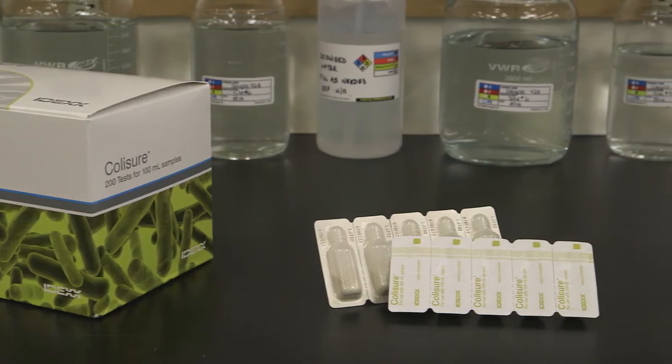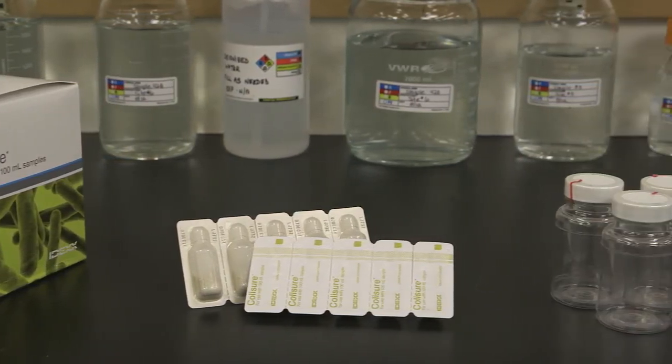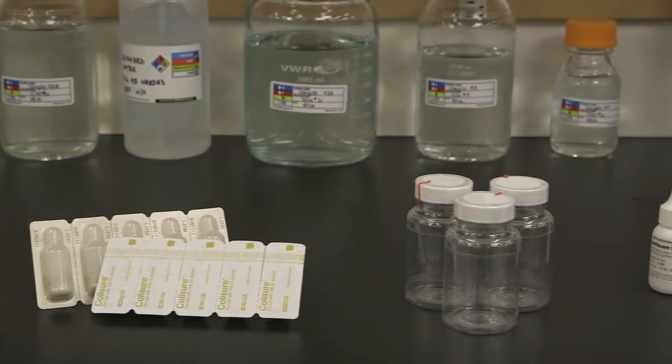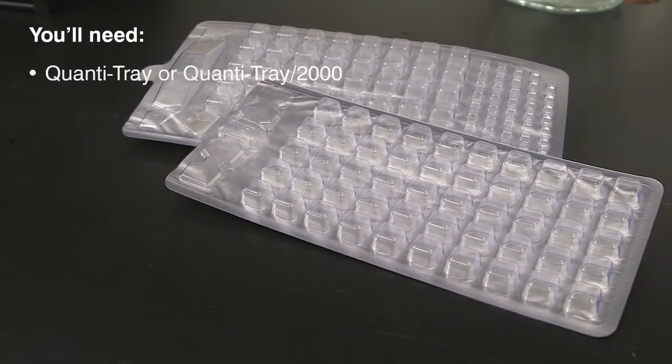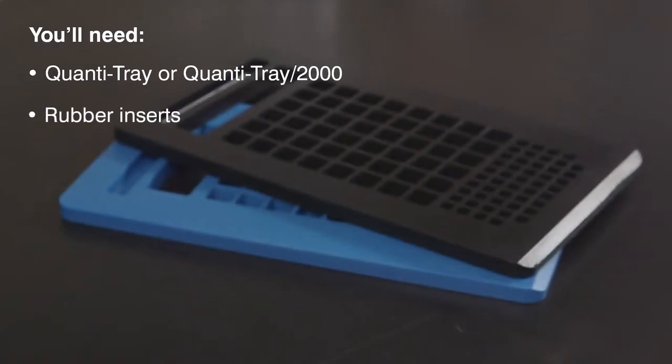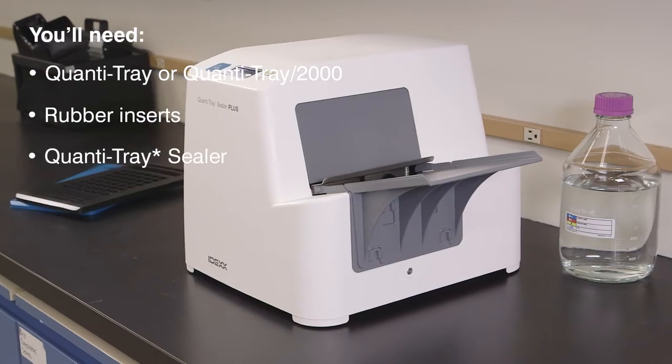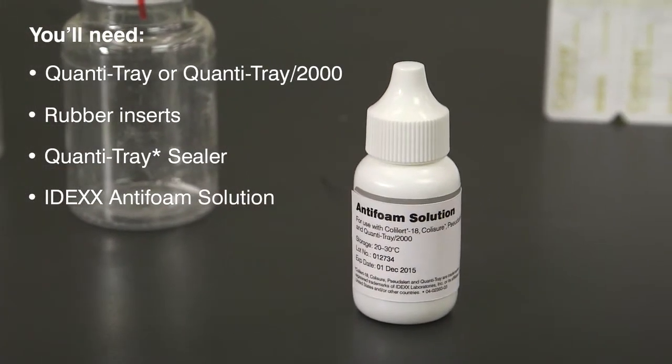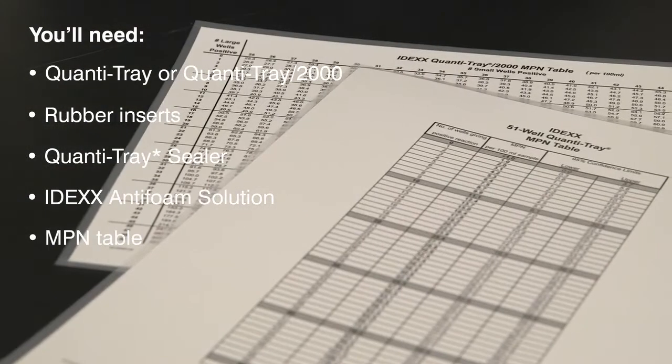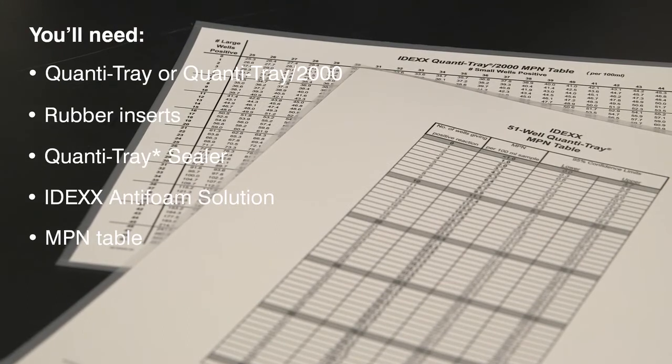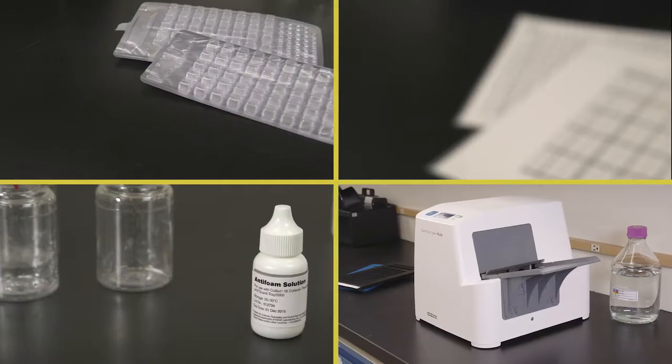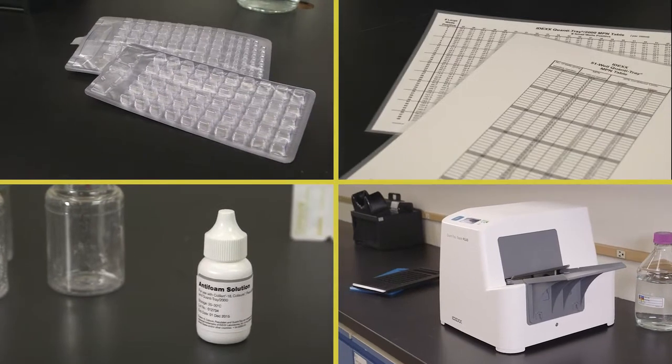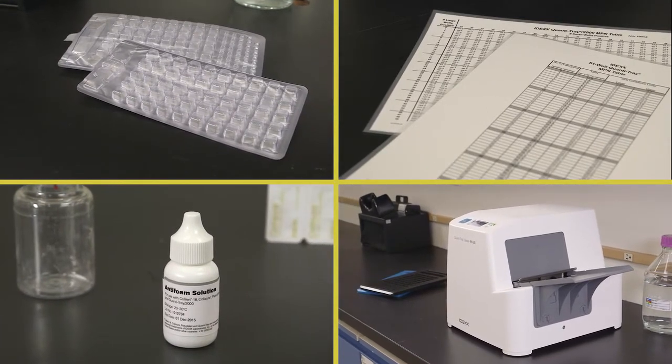In addition to the materials used for presence-absence detection, for quantification, you will need a QuantaTray or QuantaTray 2000, QuantaTray rubber inserts, a QuantaTray sealer, IDEXX anti-foam solution, and the included most probable number table or the IDEXX automated MPN generator program found at IDEXX.com. All of these items are included in the QuantaTray system and are available from IDEXX.